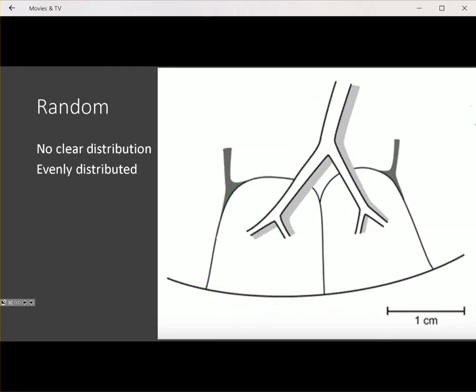So what is a random distribution of pulmonary nodules? A random distribution is where you do have some centrilobular nodules and some nodules along lymphatic distributions, but there's no clearly identifiable distribution. You have some that are centrilobular, some along what could be lymphatic distributions, and some just scattered throughout the secondary pulmonary lobule. Even though it has the term random, these nodules tend to be evenly distributed throughout a particular section of the lung — they're not clearly perilymphatic, not clearly centrilobular, just evenly distributed without a clear pattern.